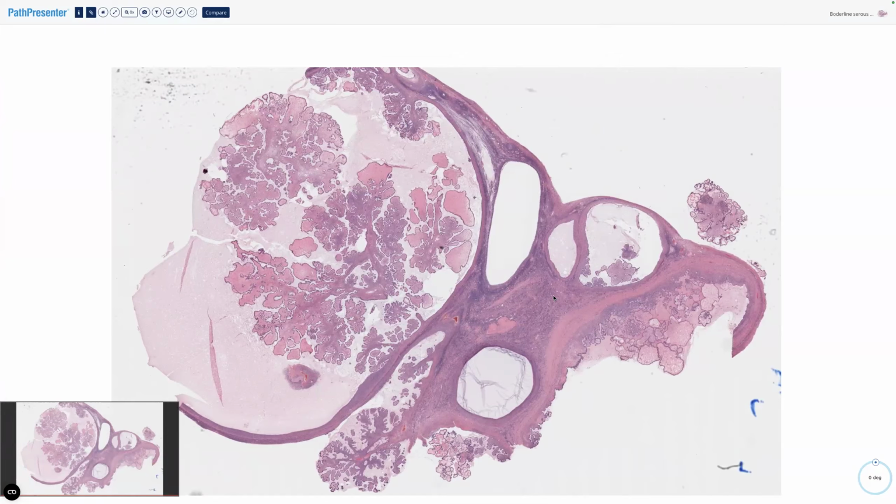If true invasion does develop in these, it invades as low-grade serous carcinoma, and sometimes it can invade from the implants, and sometimes it can invade here in the low-grade serous ovary. Okay, so bad prognostic features are the Medusa head or intraepithelial carcinoma, focal invasion, and invasive implants, which are now called low-grade serous carcinoma because they have progressed. Although they're called serous, when you open them up, they will have quite a lot of loose mucin in them.